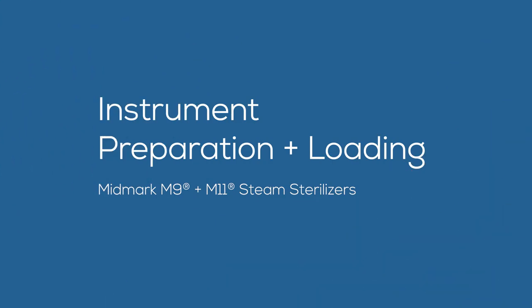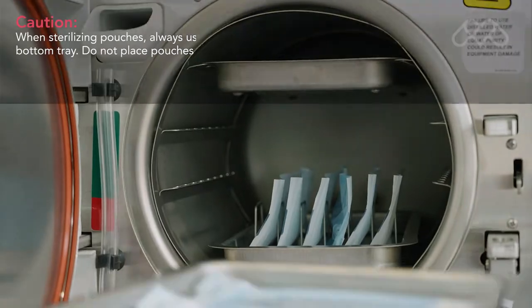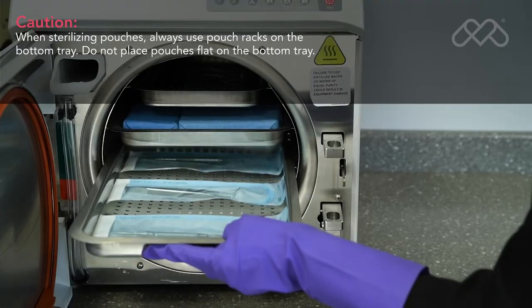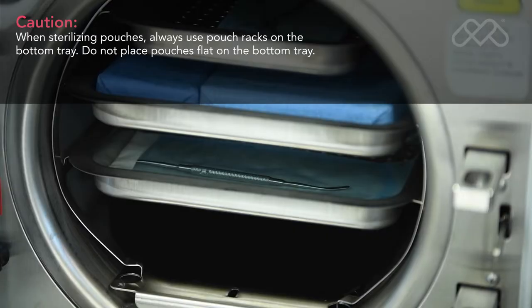This video provides an overview of the preparation of instruments for sterilization and loading of the Midmark M9 and M11 steam sterilizers. Always refer to the appropriate technical documentation for the complete list of instructions, safety alerts, and sequence of procedures before conducting any service or maintenance operations. When loading items into your sterilizer, please keep in mind that all items must be processed in accordance with the Centers for Disease Control and Prevention guidelines.